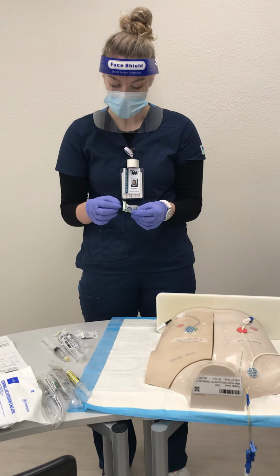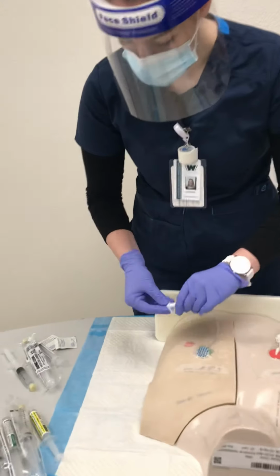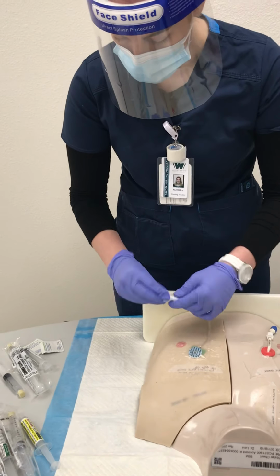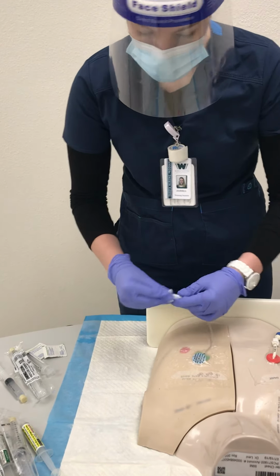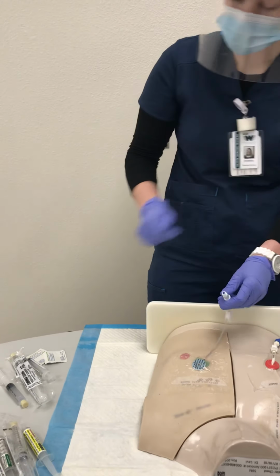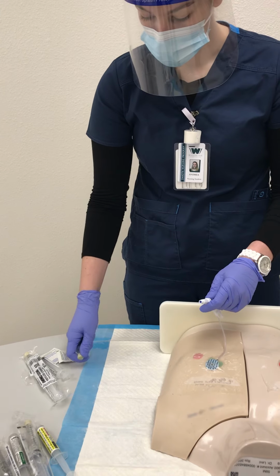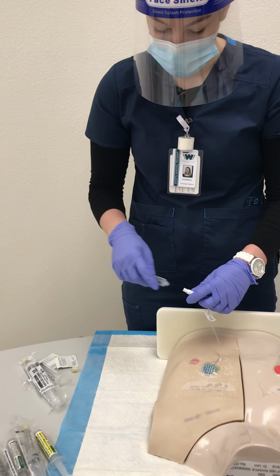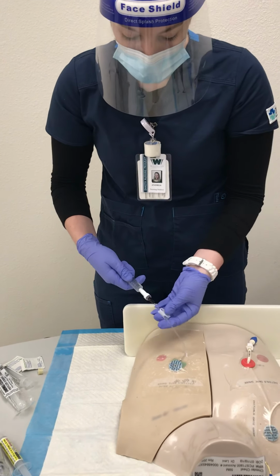So first we are going to clean the port, 10 to 15 seconds in a circular motion, then we're going to let that dry. And then we're going to grab our 10 milliliter flush. And once that is dry, we can attach the flush. And then we're going to want to unlock.